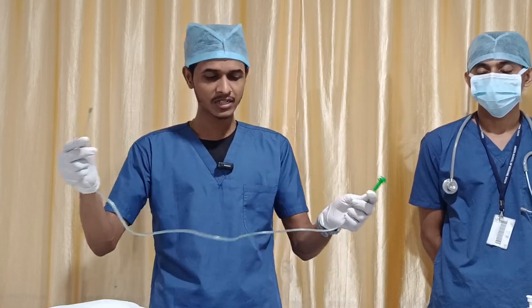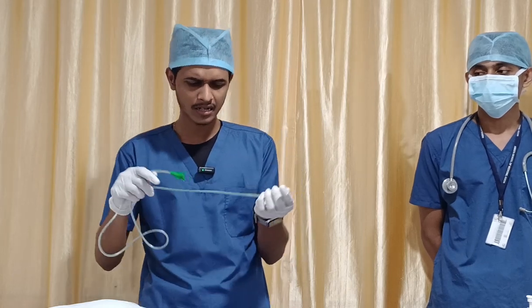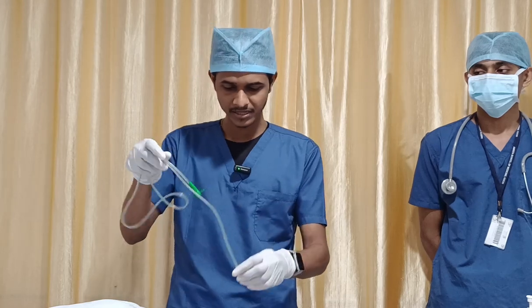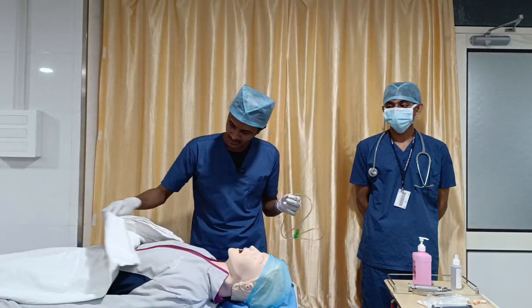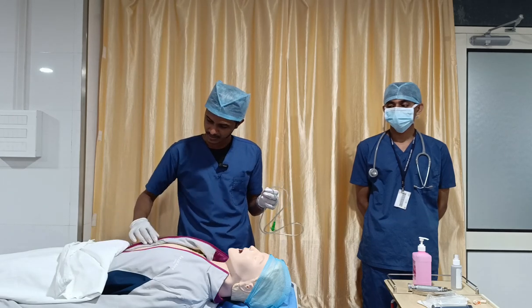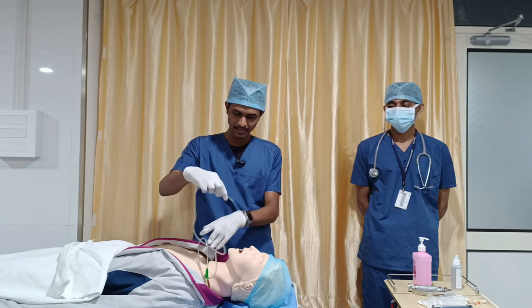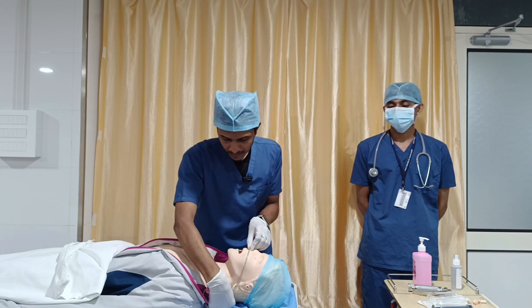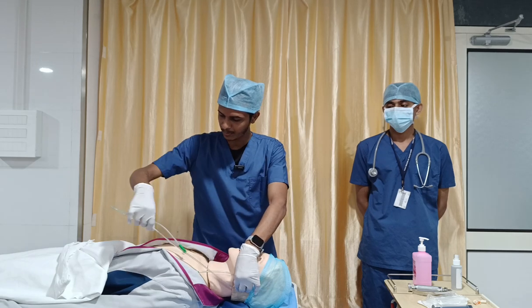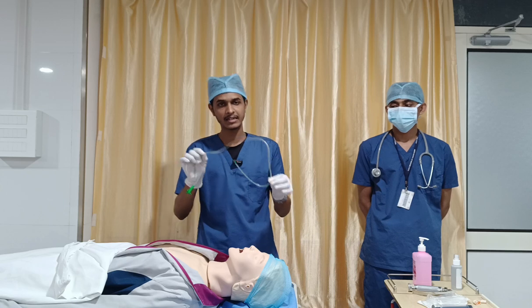Before getting to the procedure, you have to take a measurement. There are a lot of controversies and measurements being followed, but one method commonly used is this: you have to expose adequately, with the permission of the person. Then first take the distal portion of the catheter from the tip of the nose to your earlobe, and from the earlobe to your xiphisternum. That is what we commonly follow in the regular setup.